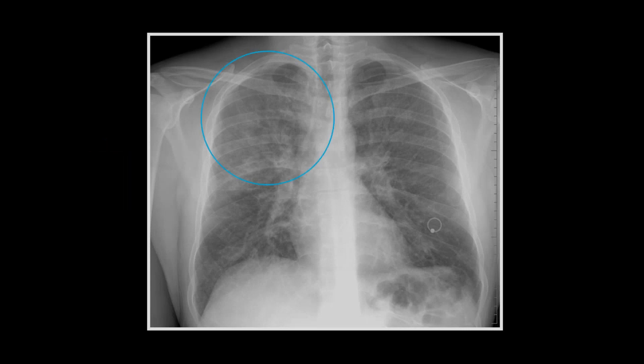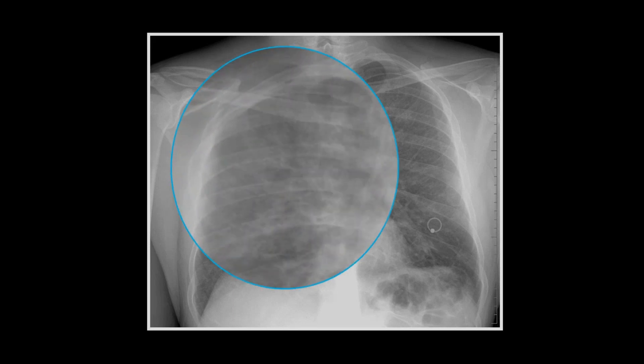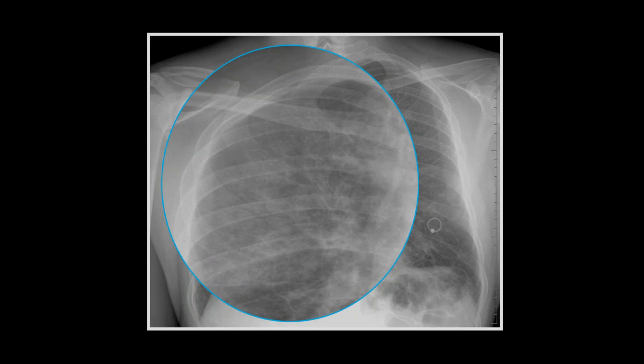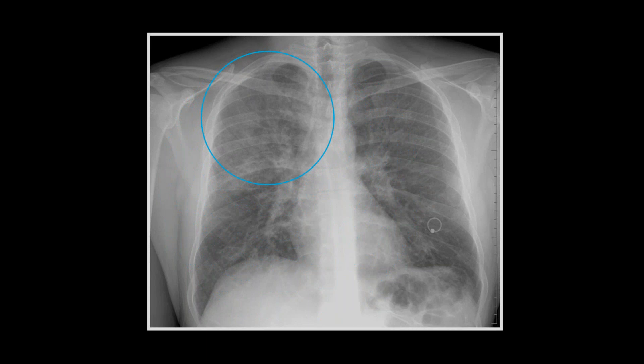Our next one is pretty subtle, but there it is — right upper lobe ground glass density. This is a case of PCP; don't say 'PCP pneumonia' because that second P stands for pneumonia. A very nice example of how subtle ground glass density can be. It's like looking at someone behind a frosted shower door — you can see that there's something there, but you can't make out detail. You're losing the lung detail you'd expect to see, which you can in fact see in the left upper lobe.